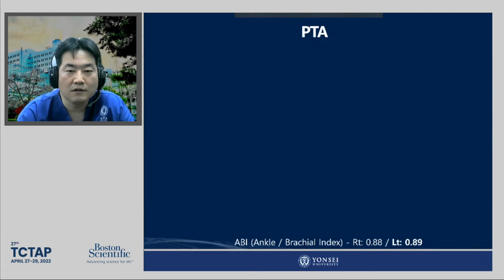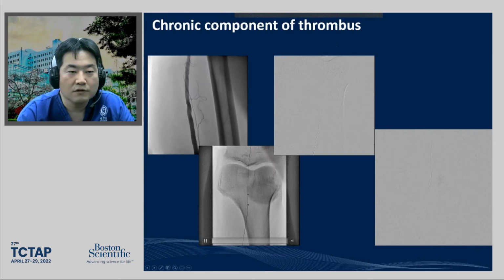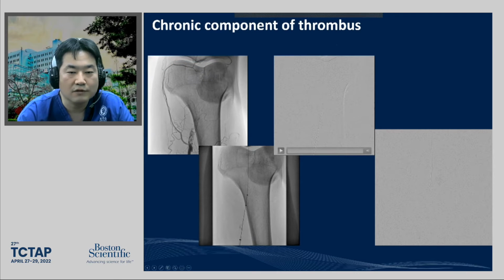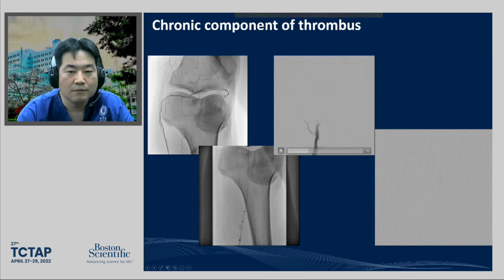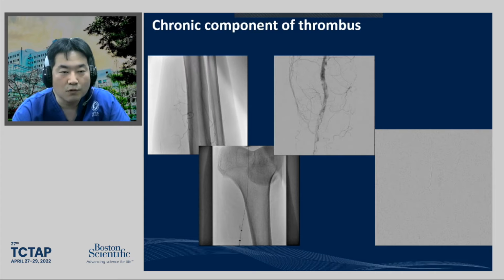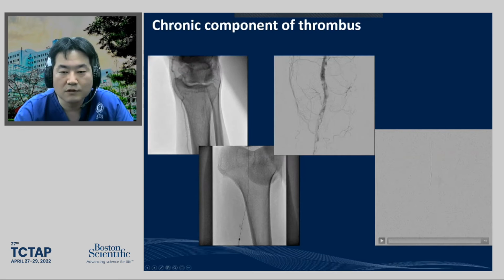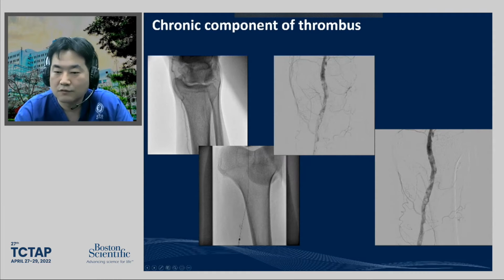But in some cases, it's a chronic thrombus. After the pulse mode was performed, you can see the thrombus and the organized thrombus material, and there is still some residual organized thrombus. So I think it's difficult for old thrombotic lesions, but in fresh, new onset lesions, the flow was much improved after the AngioJet devices. That's my case. Thank you for your kind attention.